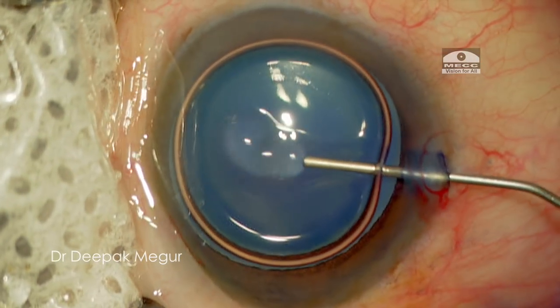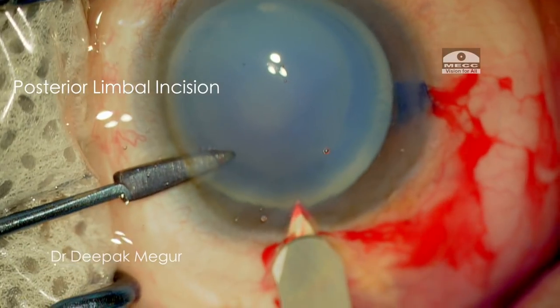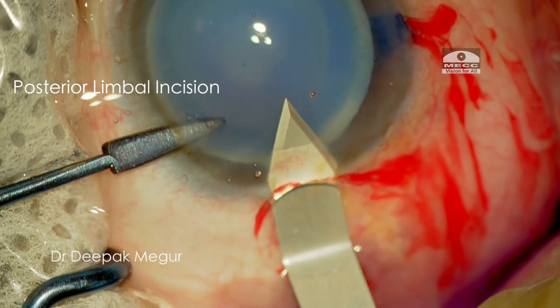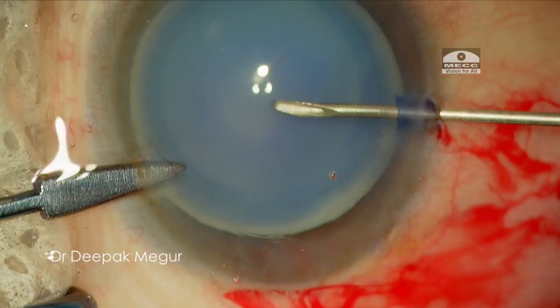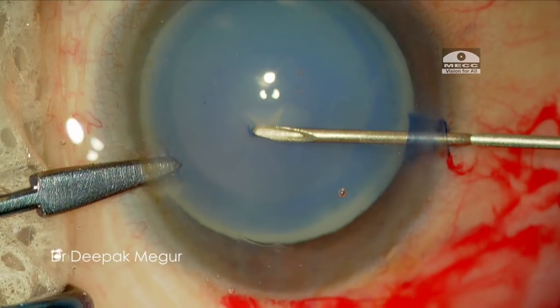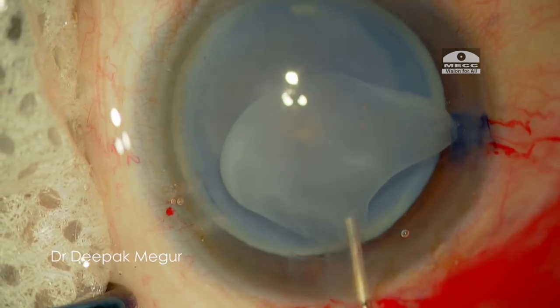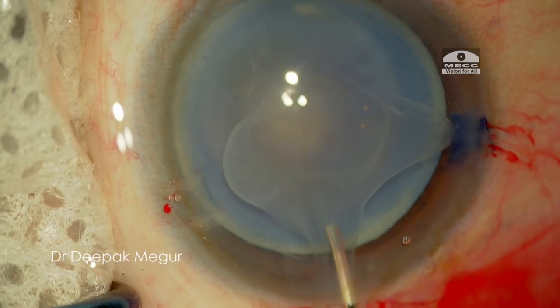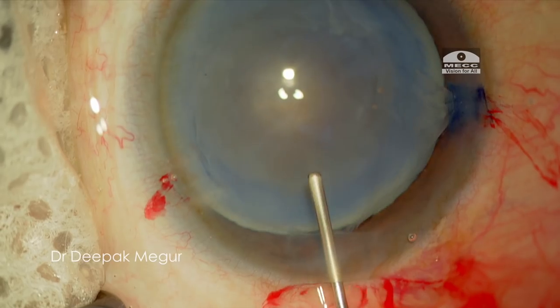This elderly lady has a hypermature cataract. Once I puncture the anterior capsule, the milky fluid comes out and hampers the visualisation. I just irrigate a little bit to get rid of the milky fluid and then complete the rhexis with the forceps.